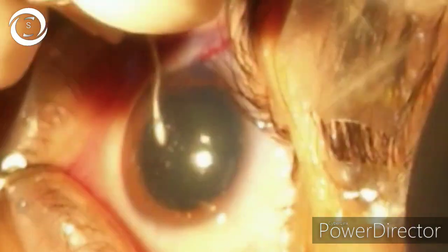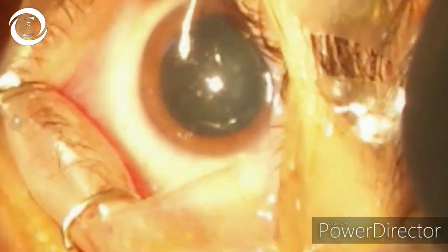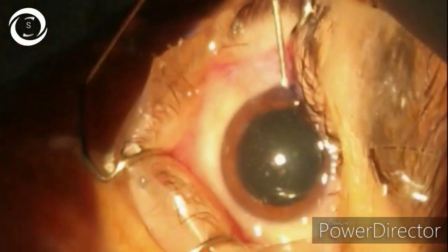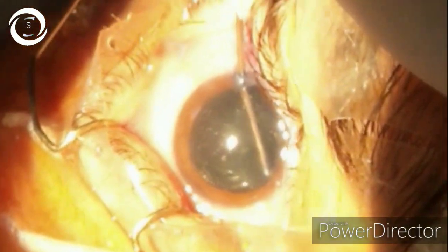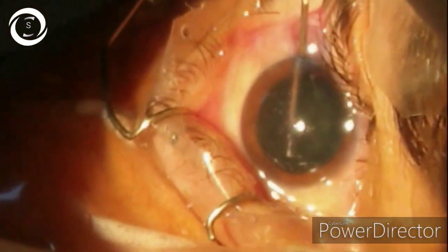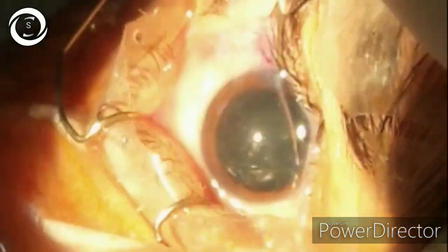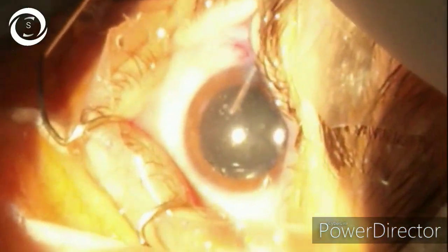It should not become radial, and you should also tell the patient not to squeeze. Now after capsulorhexis, I am doing hydrodissection. It should be very gentle because the zonules are also weak in myopic patients, so be very gentle.